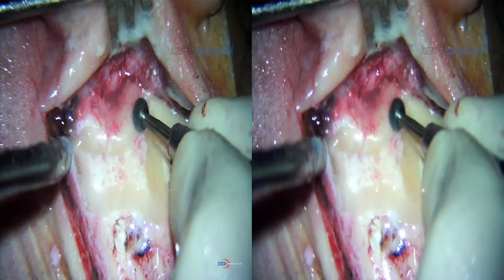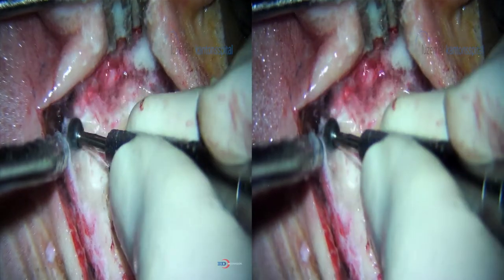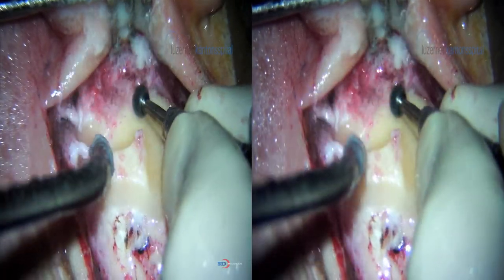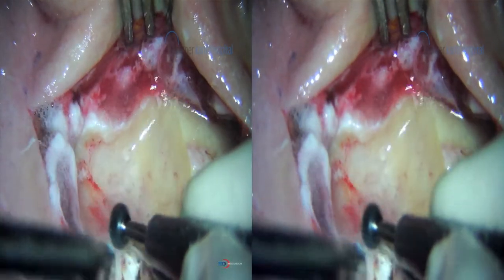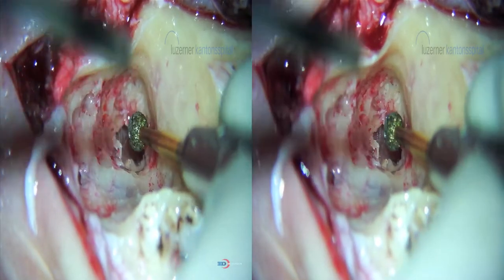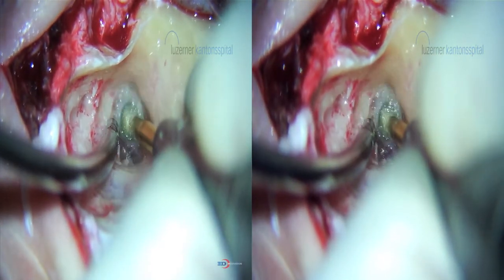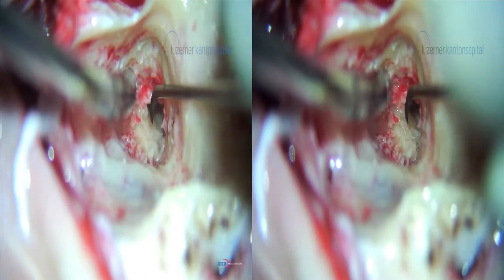An anterior mastoidectomy is performed, identifying the dura superiorly to our right side. A small overhang of bone is made posteriorly, as you can see here, to store the electrode at the end.